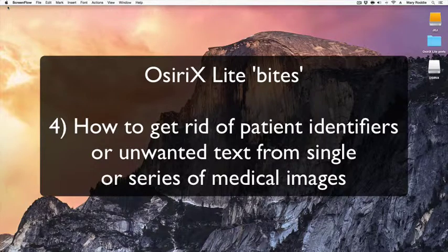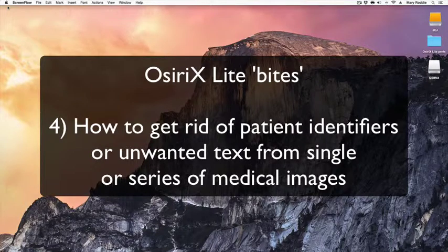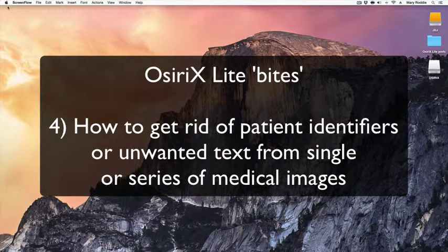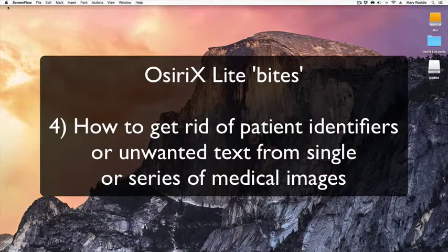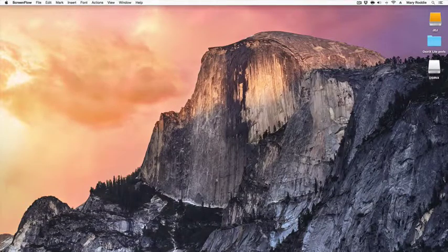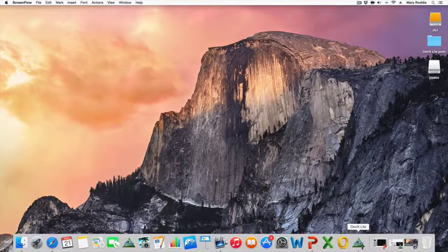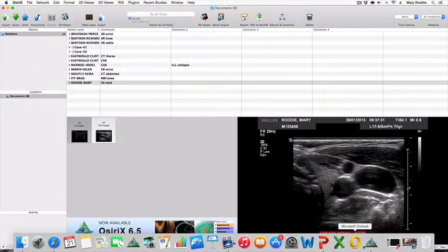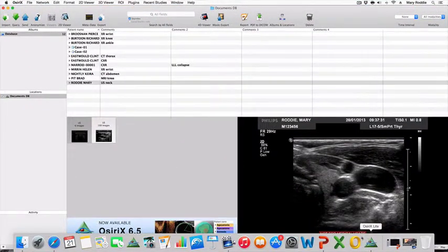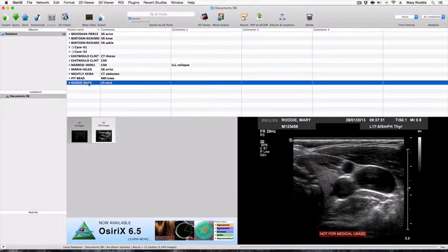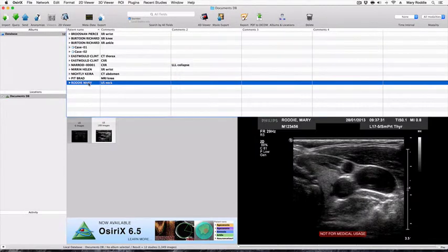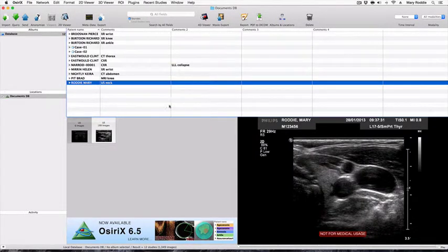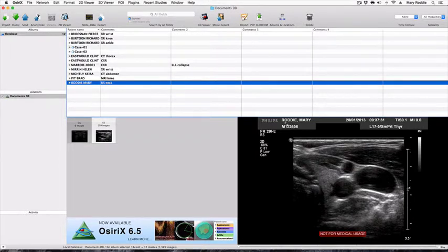We will revise how to remove patient identifiers from ultrasound images. At the time of recording, I'm using OsiriX Lite version 6.5 and you'll see here there is an ultrasound performed of myself. The problem with ultrasound images is that the patient identifiers are burned onto the image.